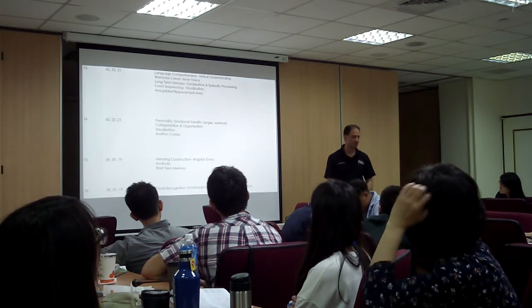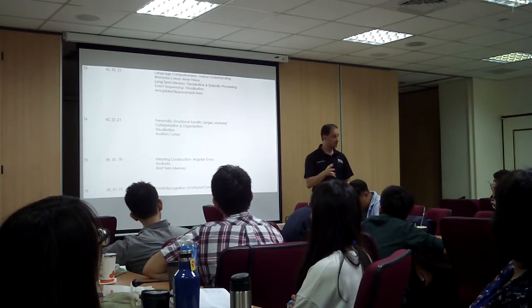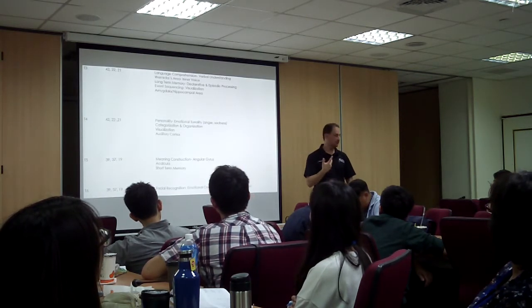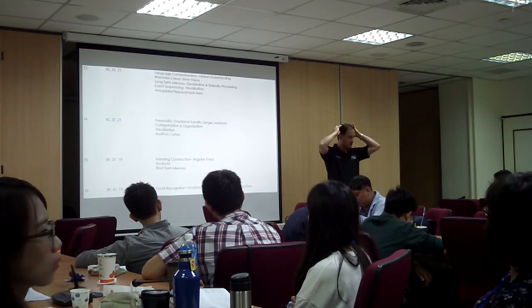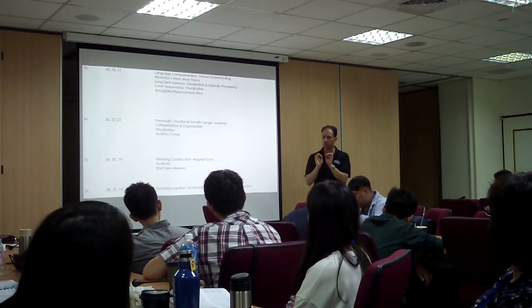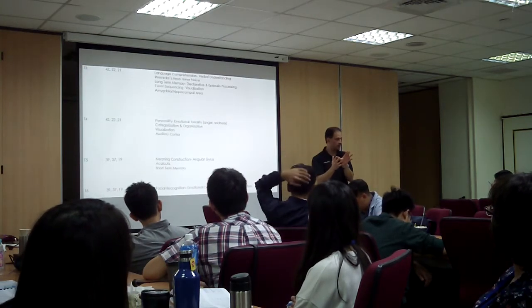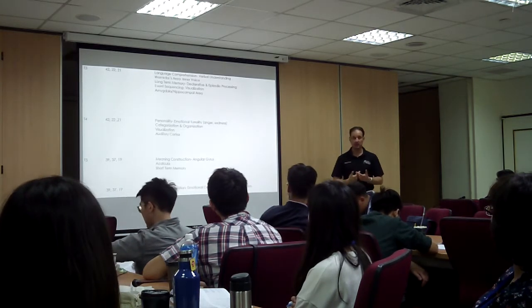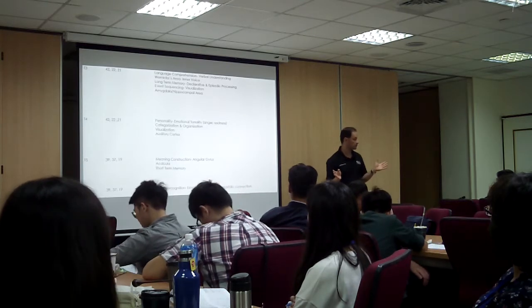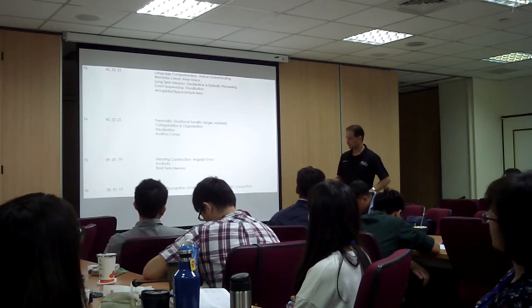We'll watch movies or something. But the interesting thing is that about 10 sessions later, he's smiling, he's talking to me, he's saying, this is fun, this is changing my life. T5, T6. It makes a huge difference when you know where to put the sensors. This is somebody who has been rigid all their life, and within the first 10 sessions, you see a big, significant behavioral change. The family was more than thrilled too. So T5, T6 is good for that.